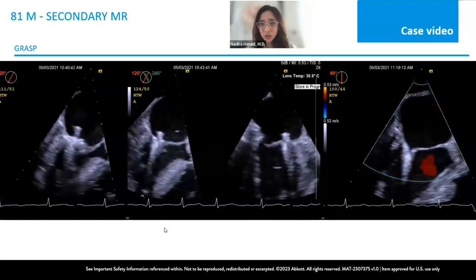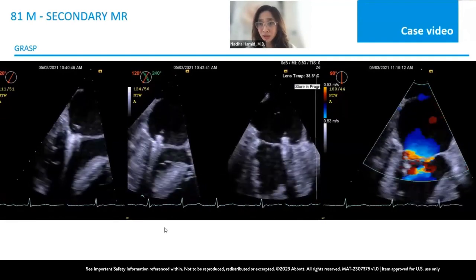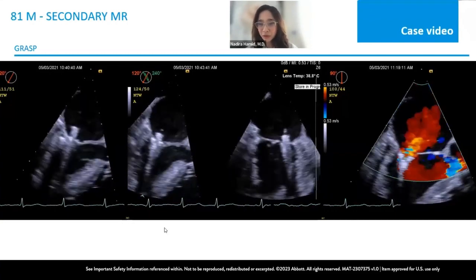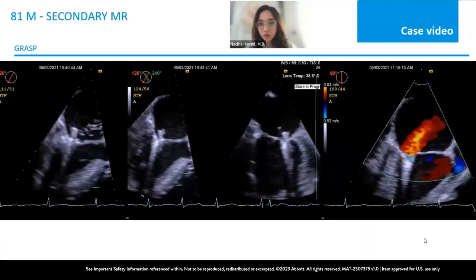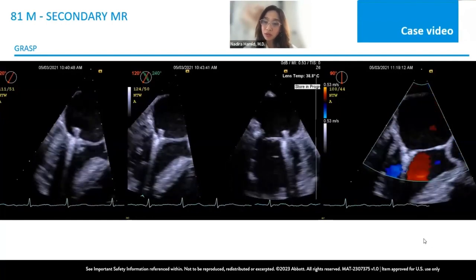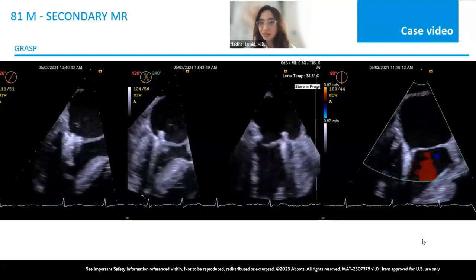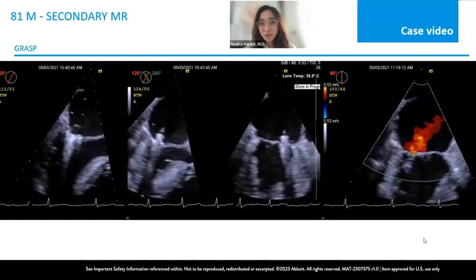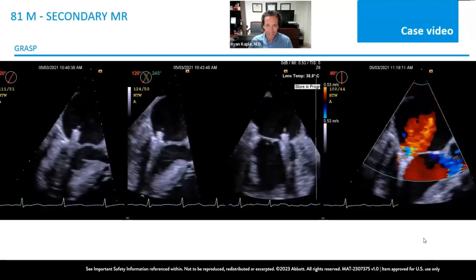I've been in cases where this hard decision has to be made instead of standing there for another 2-3 hours trying. And if after an hour or two you say, okay, I think there's a couple of steps we could improve on the transeptal, then really say, okay, let's start over. And it is okay. I would rather start over from the transeptal and get a great result than a suboptimal result. So I agree.